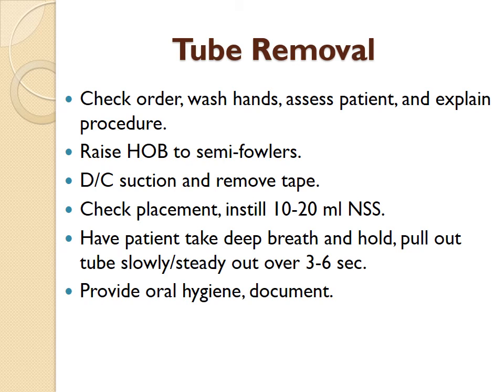Then you want to come down about 10 or so inches from where it's placed in the patient's nose, and secure a piece of tape onto it, and then taking that safety pin that you brought with you, secure it toward the shoulder area of the patient's gown, thus guaranteeing that the ports will remain above the abdominal wall.